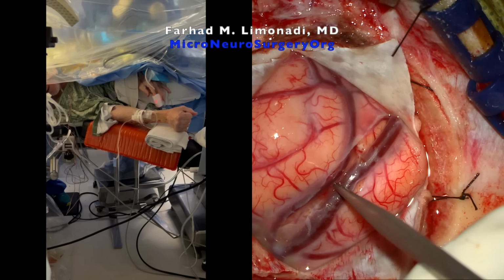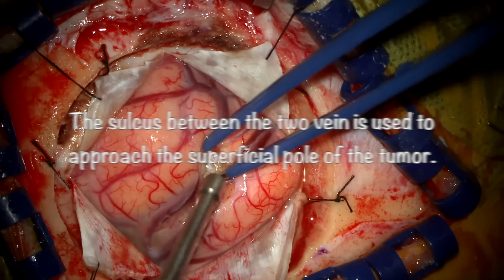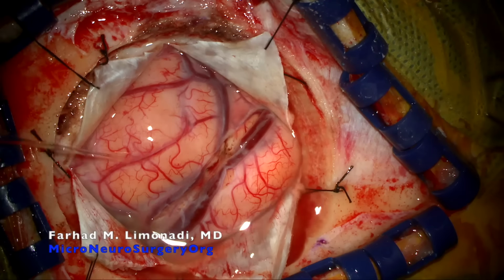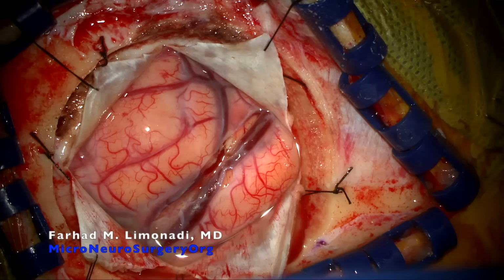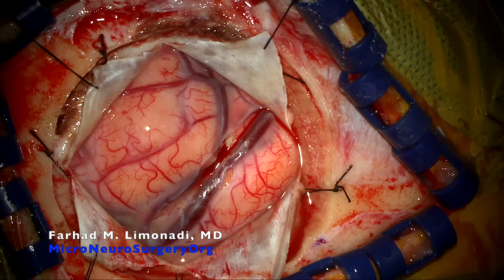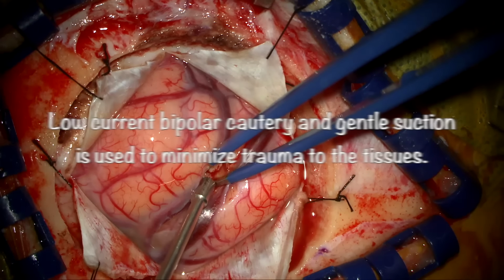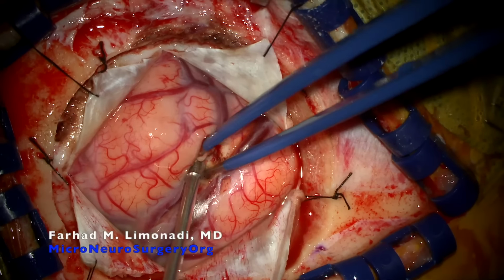And I'll let you go to Peter's. The sulcus between the two veins is used to approach the superficial pole of the tumor. Low current bipolar cautery and gentle suction is used to minimize trauma to the tissue.